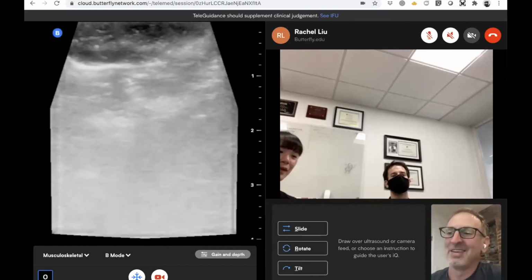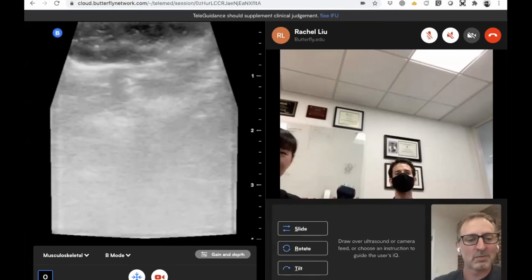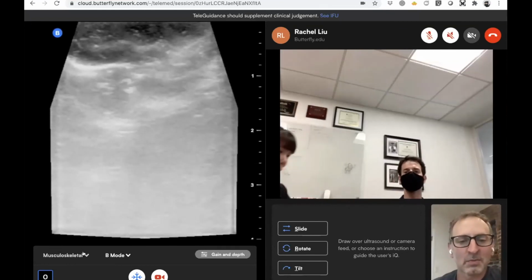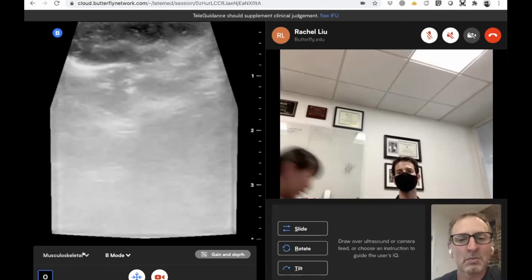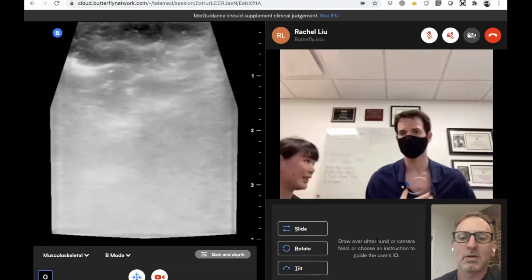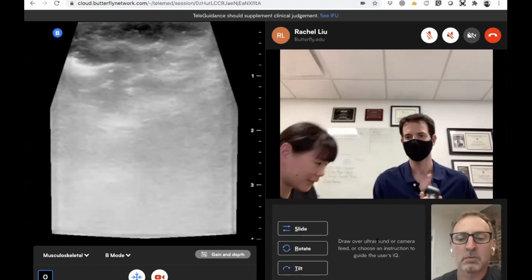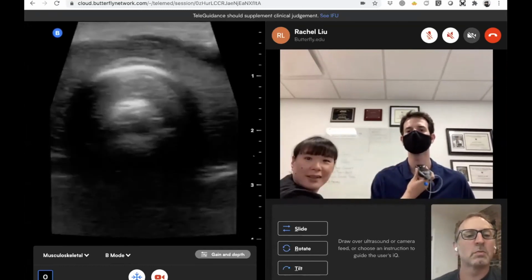Okay, thanks, Doug. So I changed myself to MSK preset, and it'll be cool because I'm going to be far away from my screen, and actually Mike can take control over something. So Mike, I might need you to give me some pointers here, Doug. Okay, so my probe marker, I'm going to keep pointed towards Doug, who's our patient, towards his right. And I'm just going to put it on his... Great.